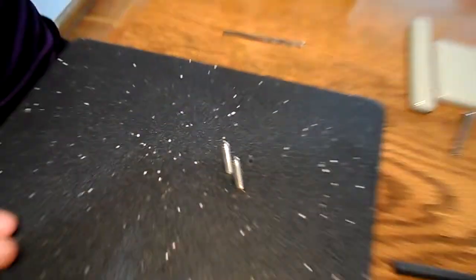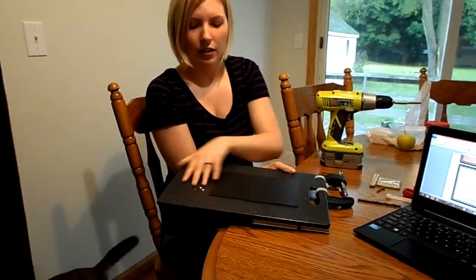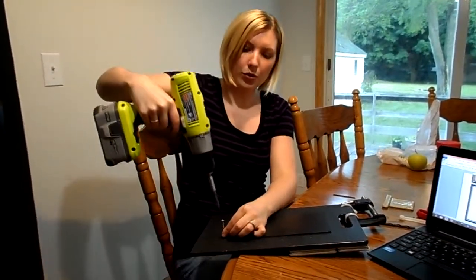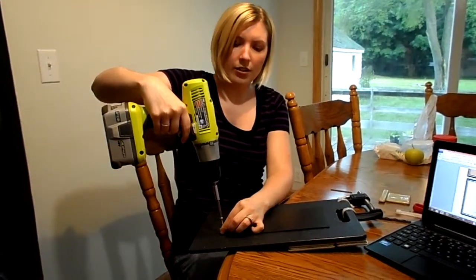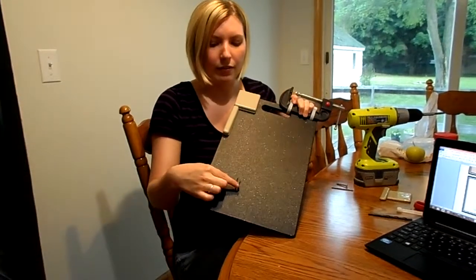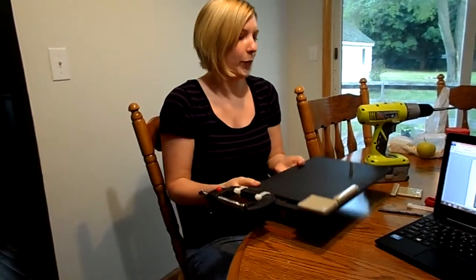So then you're just going to go ahead and take your electric screwdriver and flip the cutting board over, and then you're just going to go ahead and screw the screw all the way in until it can't go anymore, and that way you will have your screws facing up and they can hold food for you.